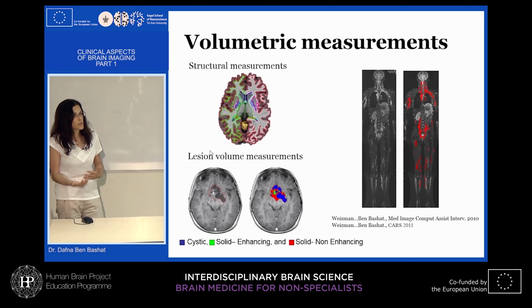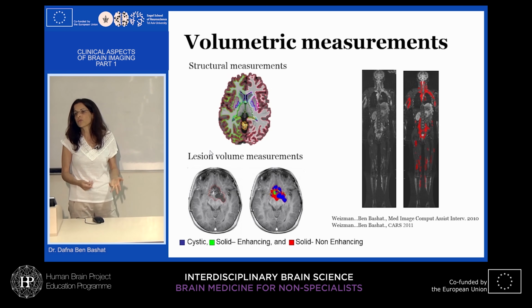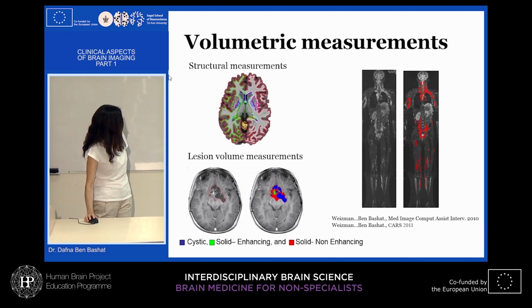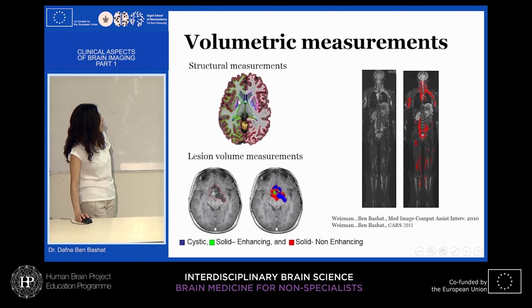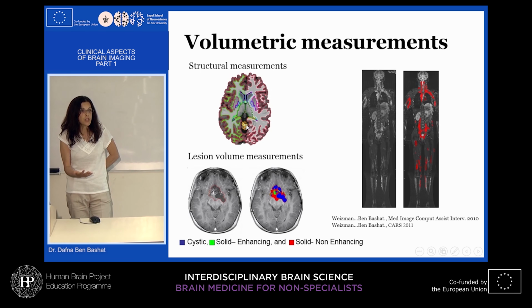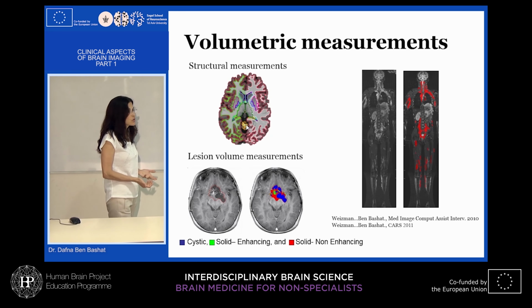That's why tools for other populations, atlases for small babies, or tools that do not use the normal brain are developed all the time. So this is just a few examples. This is a regular tool of brain segmentation that gives us information about the hippocampus, so we can learn about aging and see in Alzheimer's what the size of the hippocampus is relative to mild cognitive impairment or relative to a normal aging group.